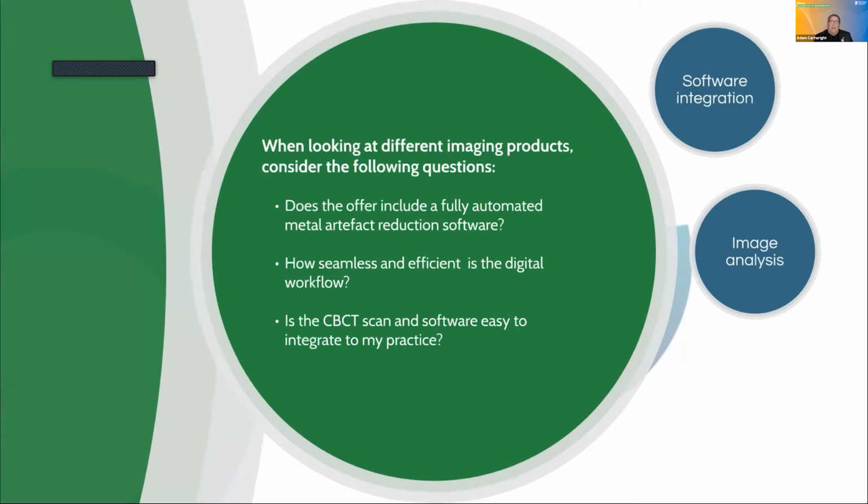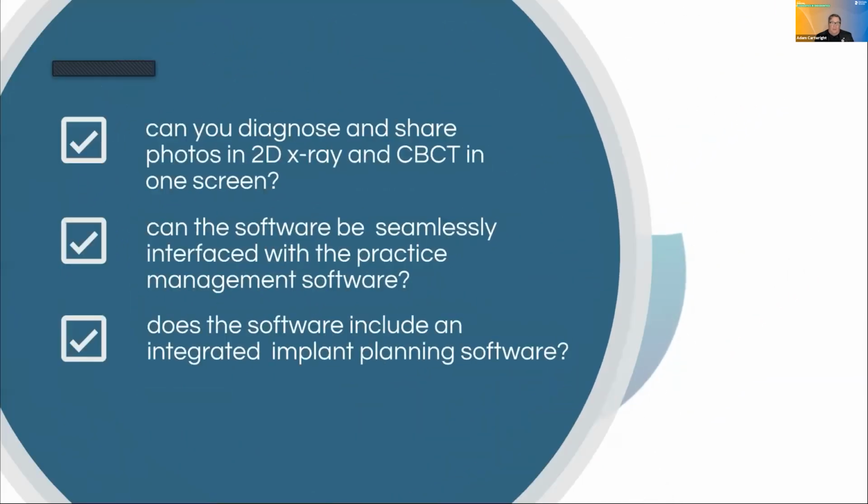It's not necessarily just about the CBCT scan. It's how the software is going to integrate with your digital impression scanner. Or if you're going down a full chairside solution with milling as well, will your CBCTs talk seamlessly, or are you having to get third-party pieces of software involved as well? And it's not just with other technology. It's also about 2D imaging with your intraoral scans, as well as potentially PANs and ceph. Can you view all of this in the same screen to make your life easier?